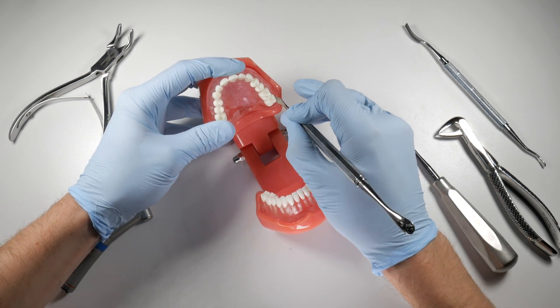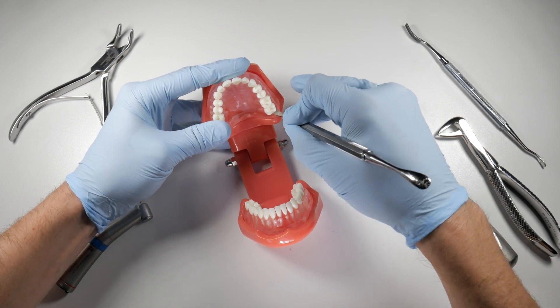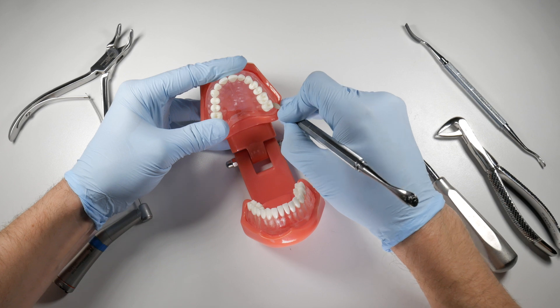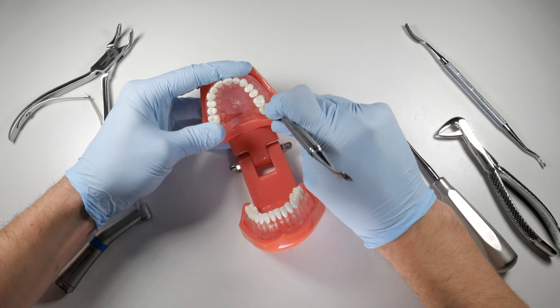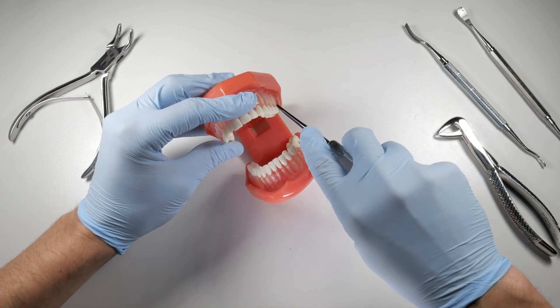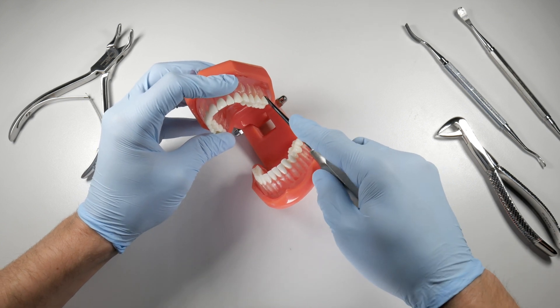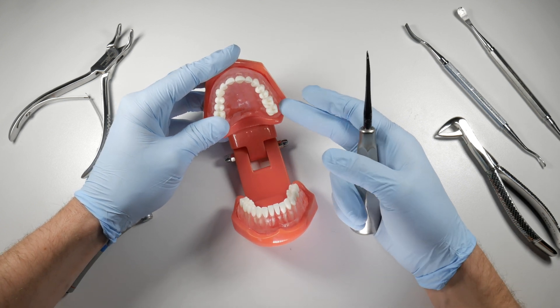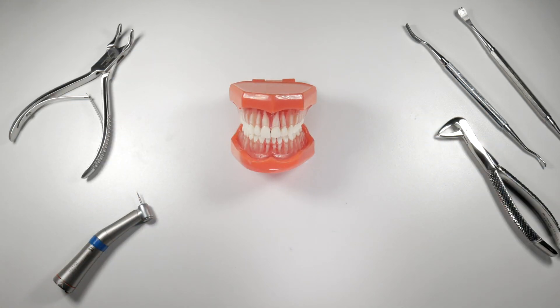For upper posterior teeth, particularly the last tooth in the arch like an upper second molar, you can use a periosteal elevator or another elevator to access the distal-buccal and buccal aspects of the tooth. Push hard at the very beginning to separate bone from tooth and create a little space before you start elevating. A luxator can also work, though it can be difficult to access that area without a specially angled instrument. Do whatever you can to separate the buccal bone from the tooth prior to elevating — if the bone does break, at least it's less likely to be adhered to the tooth.